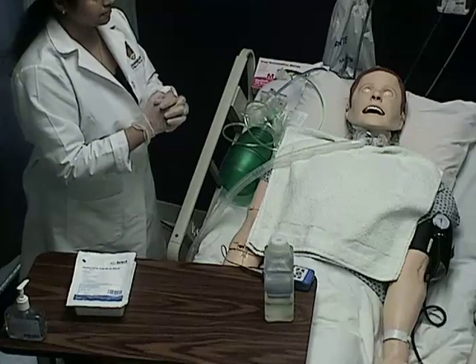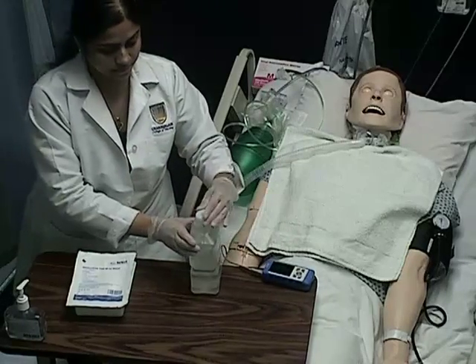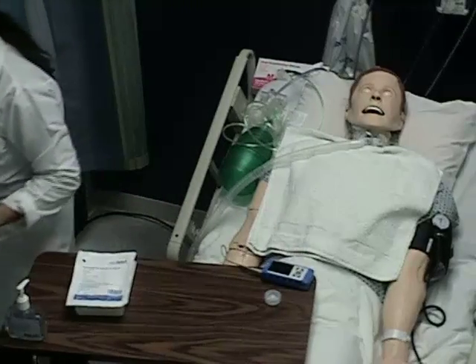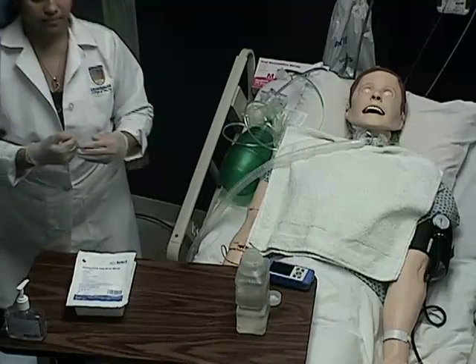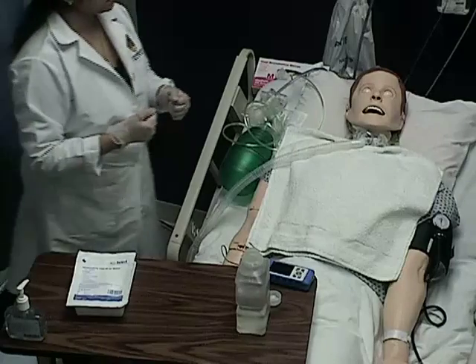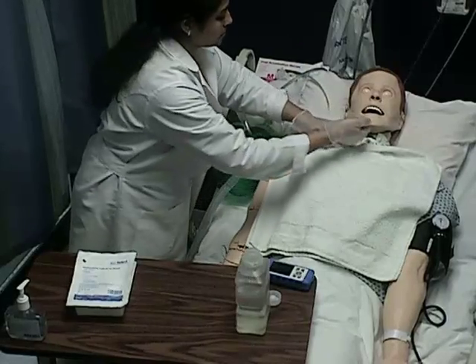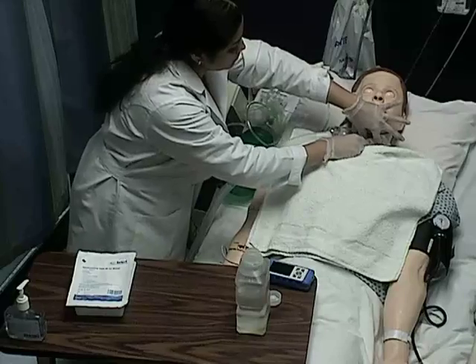Remove lid from sterile saline and place it upside down on the table. Make sure to lip the bottle. Next step, remove or place the trach collar to the side so that you may remove the trach dressing and inspect underneath the faceplate. You also should inspect the balloon and ensure that the cuff is inflated.